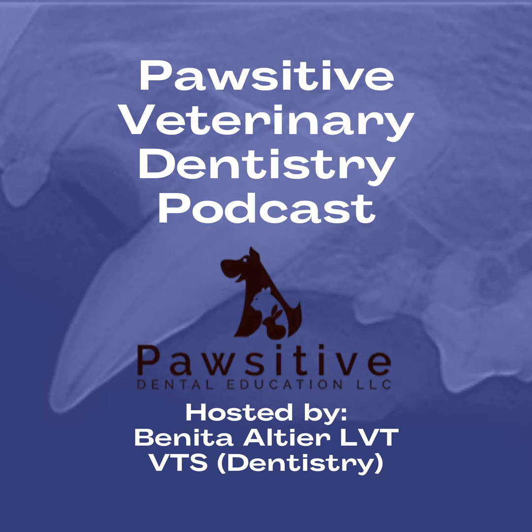Yeah, especially the more normal images that you can look at, it's just like anything. The more hearts you listen to, the more that you can pick up the sounds when there's a murmur or an arrhythmia or if there's something else going on. The same is in effect for dental radiographs. The more that you can look at what a normal tooth looks like, as far as where the bone height should be, as far as what the periodontal ligament should be.